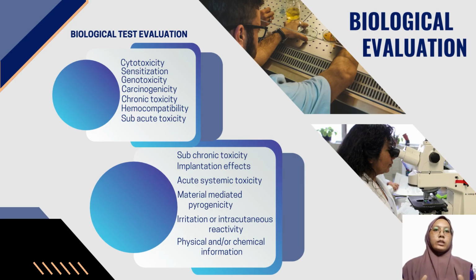By referring to the table of biological evaluation tests, these are all the tests that need to be done except for two, which are reproductive developmental toxicity and degradation. Synthetic vascular grafts are not related to the reproductive system, and since they are made out of synthetic material, they are non-biodegradable.